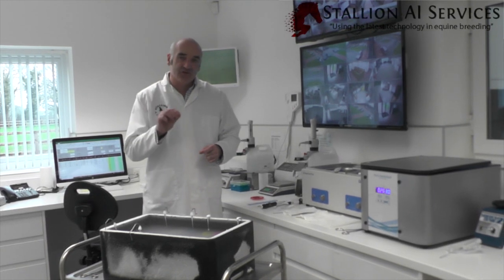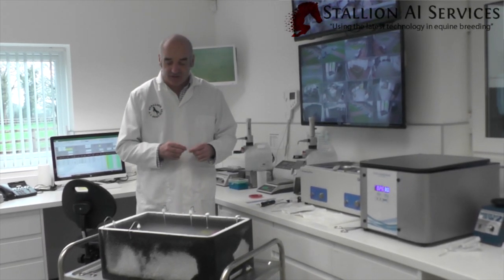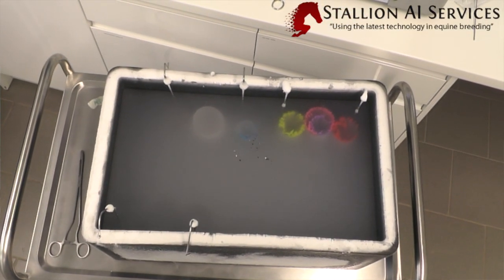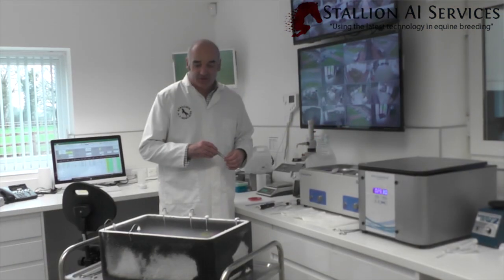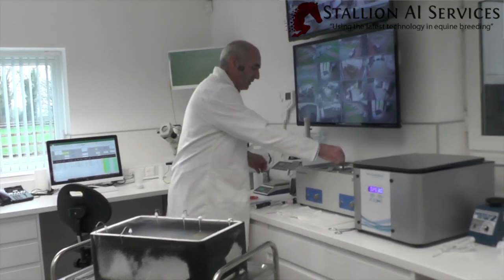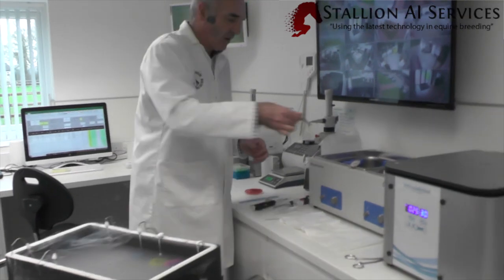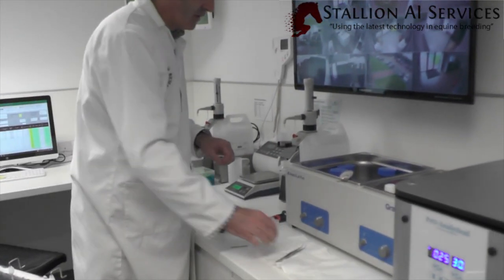We always take two straws from every ejaculate so we can hopefully get a good portion of the semen and know what it's like. We've got the semen here in the liquid nitrogen and all we're going to do is take the straws out. We have a water bath here set at 37 degrees. We make sure we've got the right stallion, pop it in the water bath, and then we wait 30 seconds for it to thaw out.